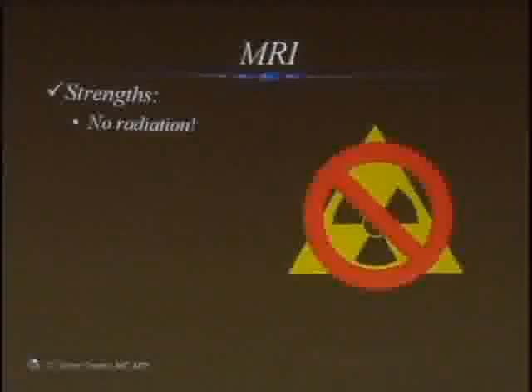There's a big thing that nobody said in the newspaper and nobody knows about. 3 years ago, they had all these strict criteria where they would deny MRIs left and right. Now, they're not denying much of them anymore because their power is so clear in the literature about how much it helps. Okay, so let's talk about MRI now. We've moved on to the next one. Its strengths: no radiation, none.